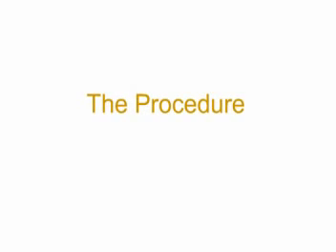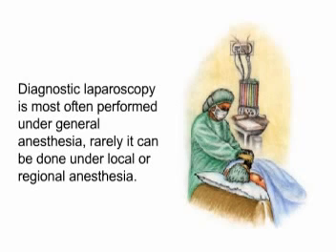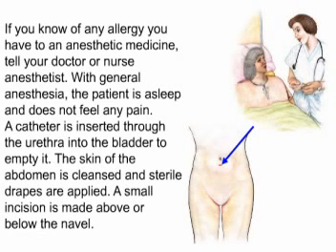The procedure. Diagnostic laparoscopy is most often performed under general anesthesia. Rarely it can be done under local or regional anesthesia. If you know of any allergy you have to an anesthetic medicine, tell your doctor or nurse anesthetist. With general anesthesia, the patient is asleep and does not feel any pain.